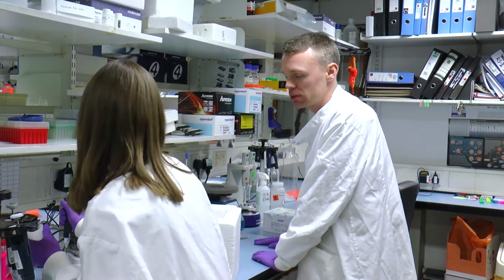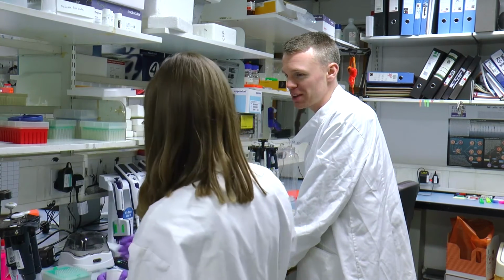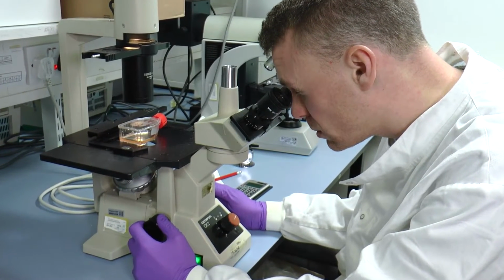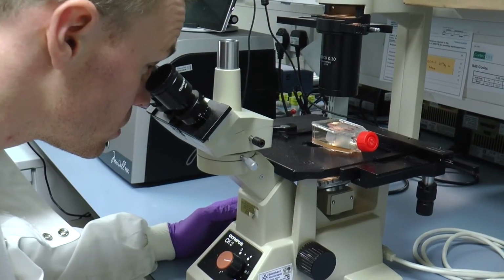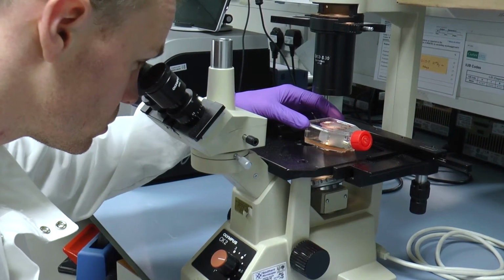The HLA genes are molecules of the immune system that help us recognize self from non-self. HLA typing is performed for a number of different reasons, including drug hypersensitivity testing and disease association work. But at Anthony Nolan, we are very interested in HLA typing because of its role in transplantation. So we're looking to match patients and donors at the highest resolution possible for their HLA genes to ensure that they have a minimal risk of the donor graft cells seeing the patient as something that they don't recognise and mounting a large immune response towards that.